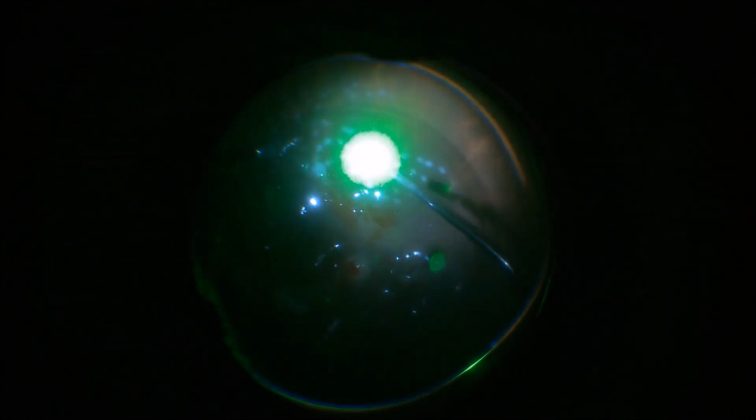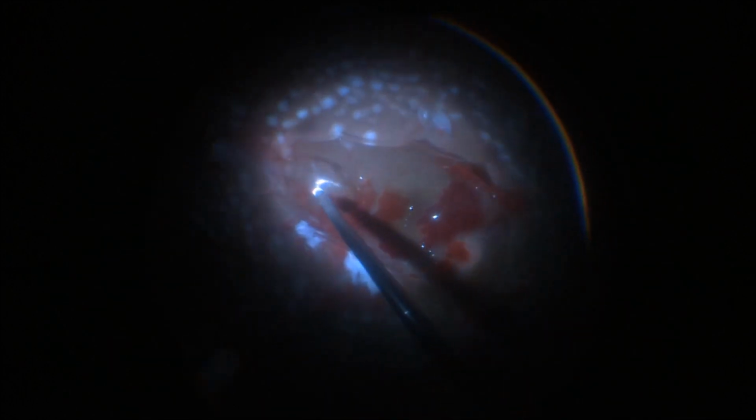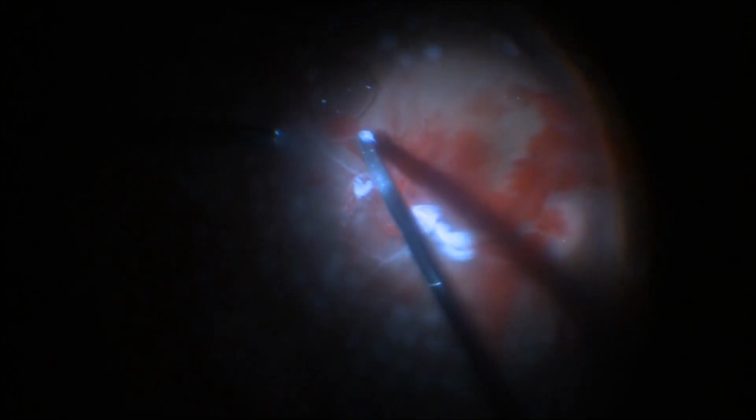Once the vitreous is completely removed, pan-retinal photocoagulation was done. This was followed by removal of the PFCL bubble. Remnant membranes and residual blood clots were removed.